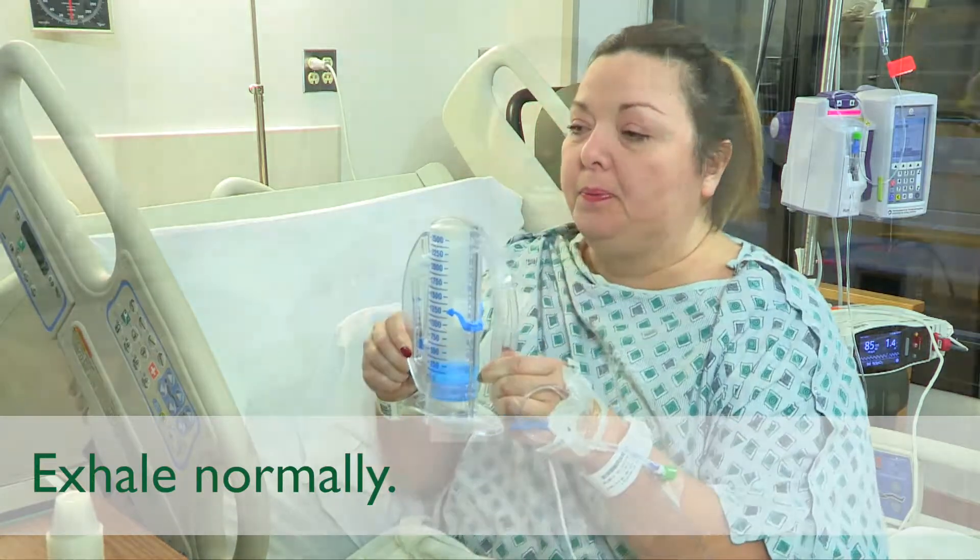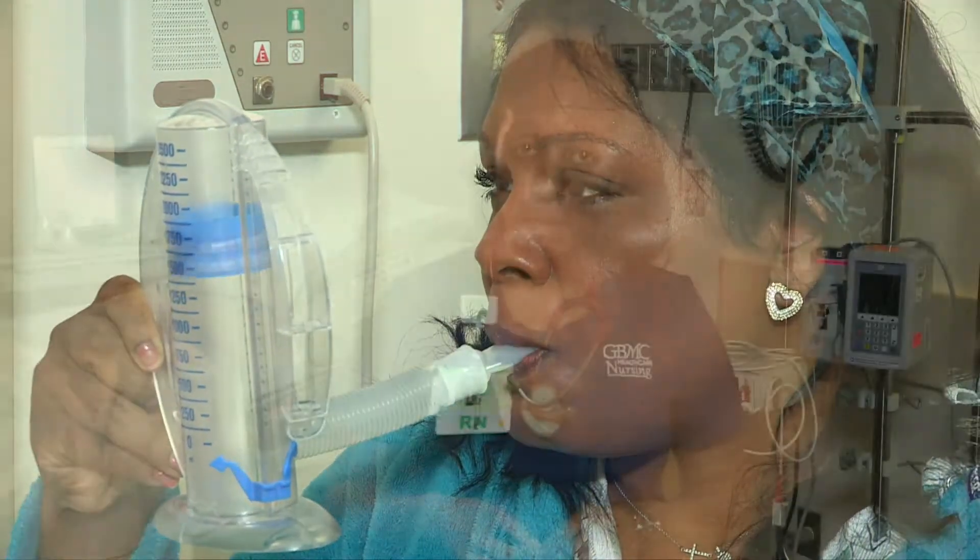Your goal is to keep your lungs expanded to prevent atelectasis or lung collapse and pneumonia. It's all about quality and not quantity. Use this machine once every 10 minutes or a few times during every TV commercial break.